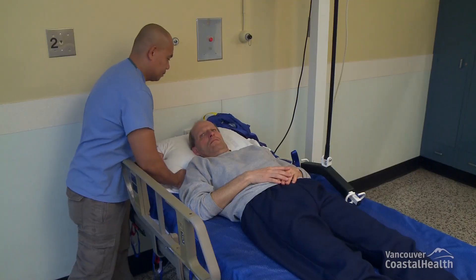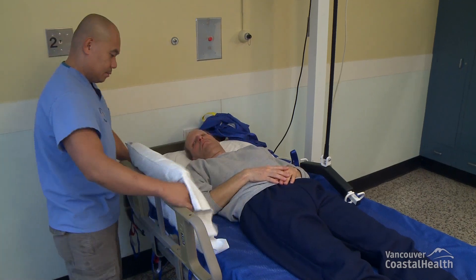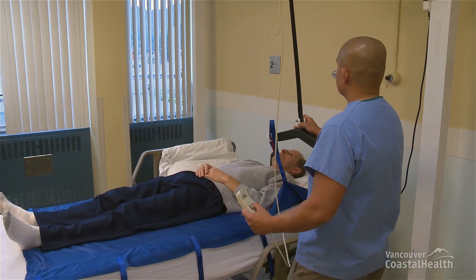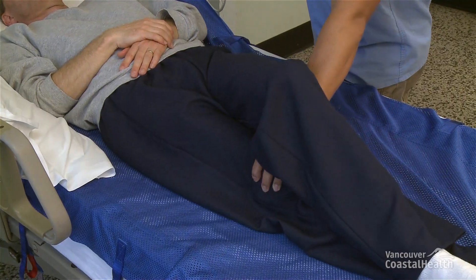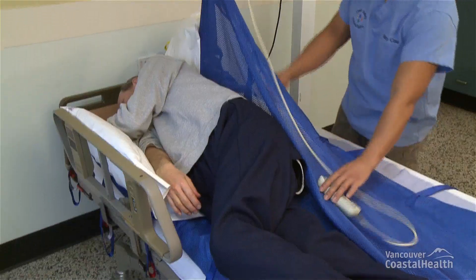Ensure that there is a pillow under the resident's head. Press the handset up button and start raising the carry bar. Cross the resident's legs to assist with the turn. Stop when the resident is lying on their side.